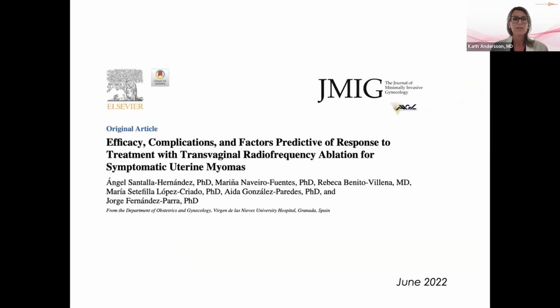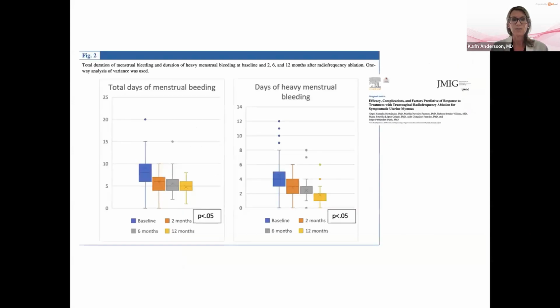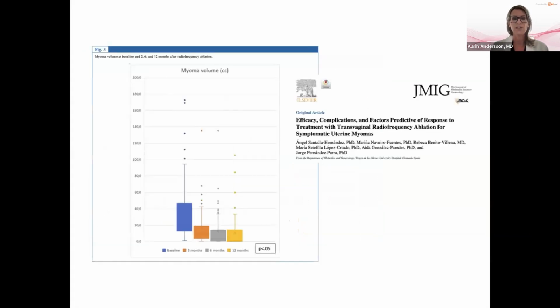This is another important article talking about the efficacy, complications and the predictive factors to response or treatment. And here we can see how the total days of menstrual bleeding are decreasing, and the days of menstrual bleeding decrease in a significant way, which is very good results, and also, of course, contributing to the quality of life aspect of the patients treated.